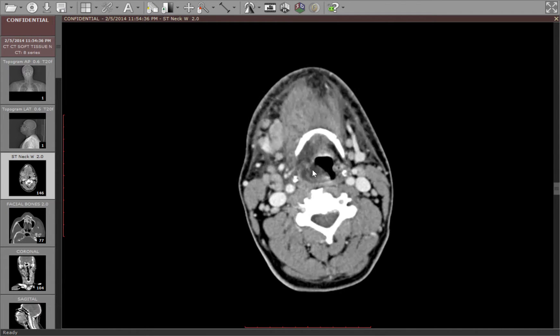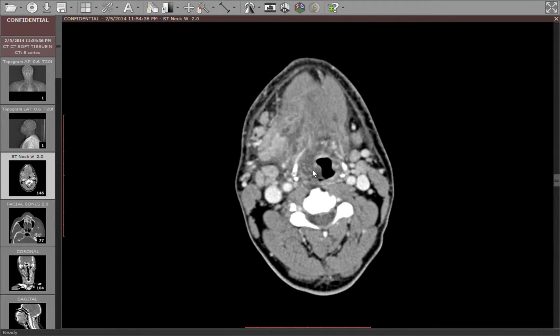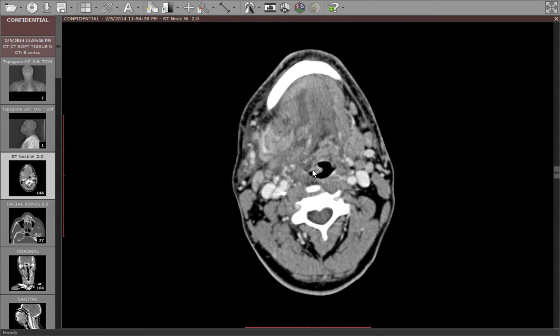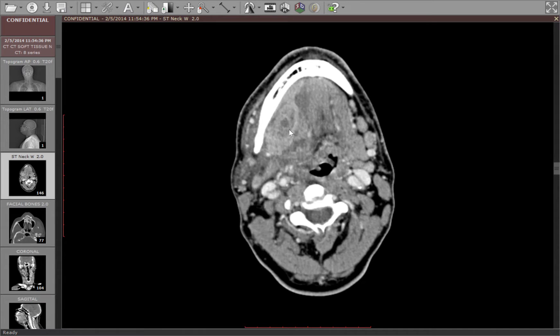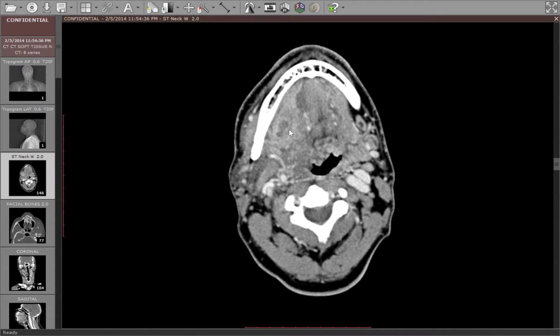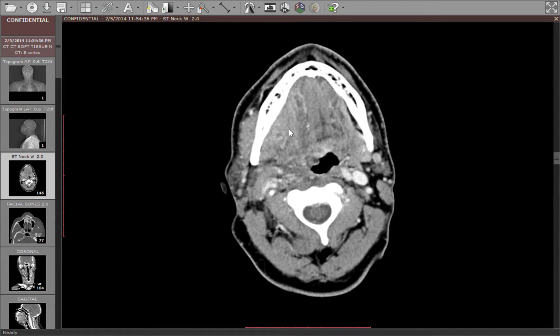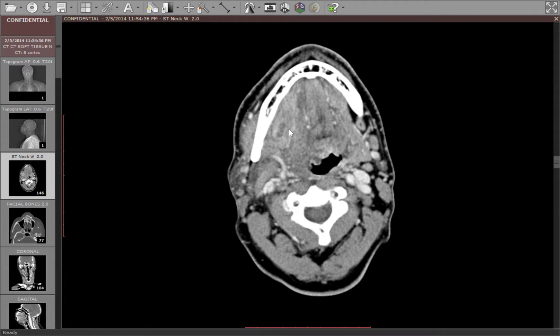So something's going on here. These rim-enhancing fluid collections are very suspicious for abscesses, and these are located in the floor of the mouth.